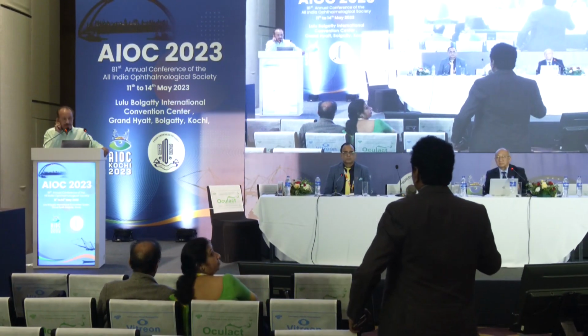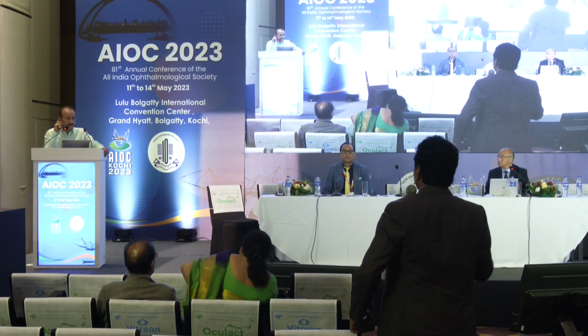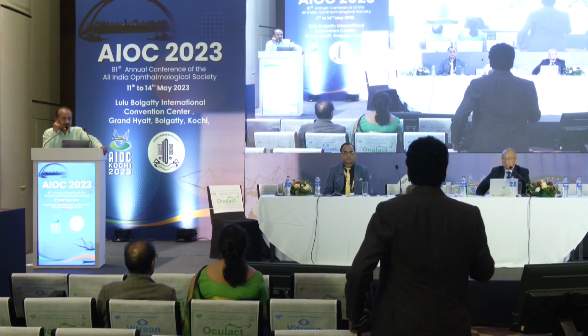Yes, Professor, there was this post-RK patient in whom you had explanted the IOL from the bag because there was a refractive surprise probably. Why didn't you go in for a sulcoflex or some lens like that and correct the error? Instead of taking the whole lens out and causing so much trauma, we could have just gone in for a sulcoflex IOL or post pseudophakic correction complementary IOL, as they would like.